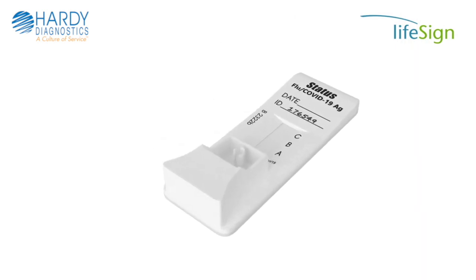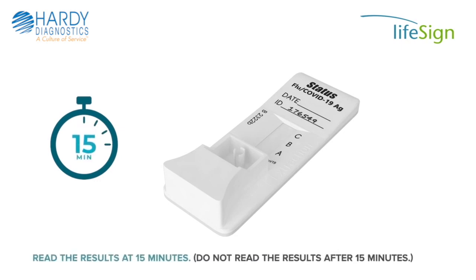Lay the test device back down onto a flat surface and set a timer for 15 minutes. Read the results at 15 minutes. Do not read the results after 15 minutes.